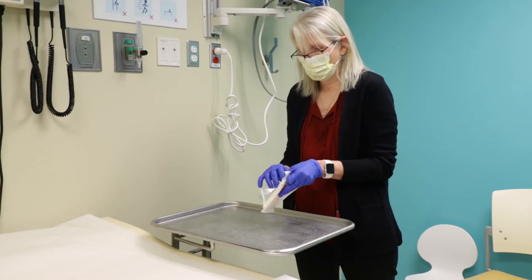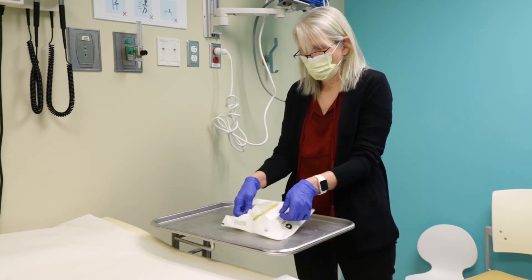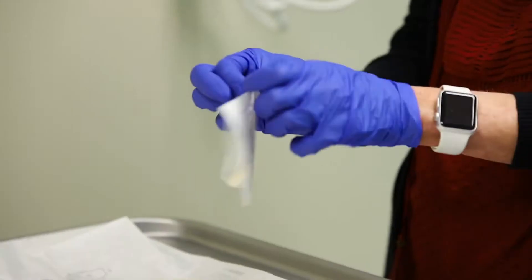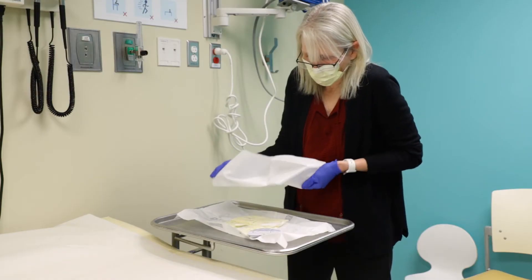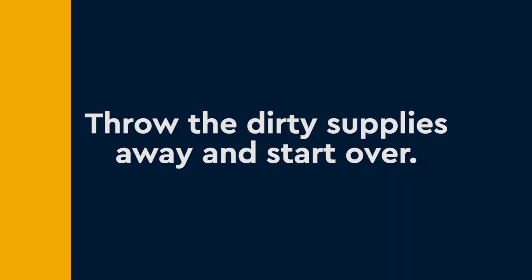Now it's time to set up your sterile field. Be very careful with this process. If anything touches something that is not sterile, throw the dirty supplies away and start over.